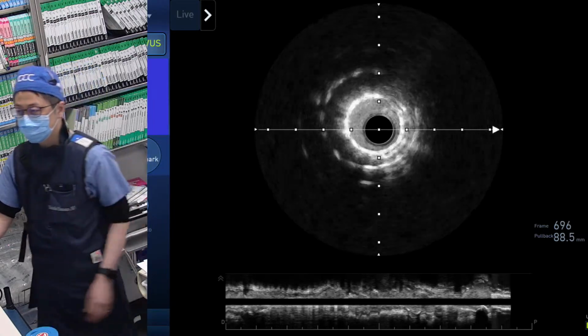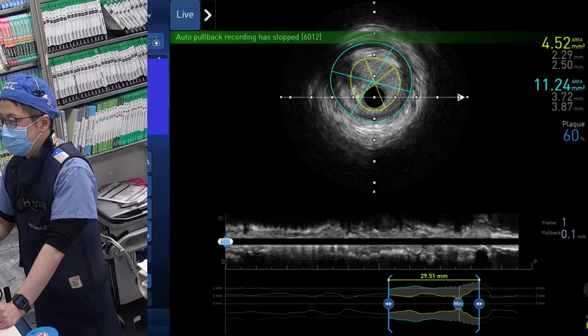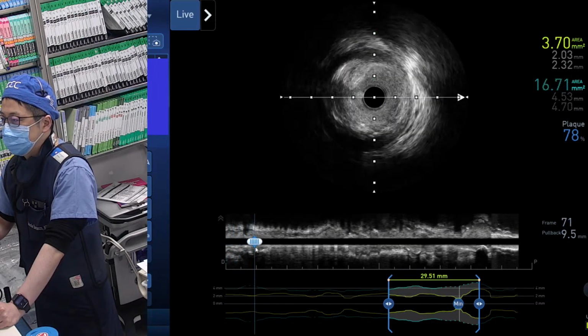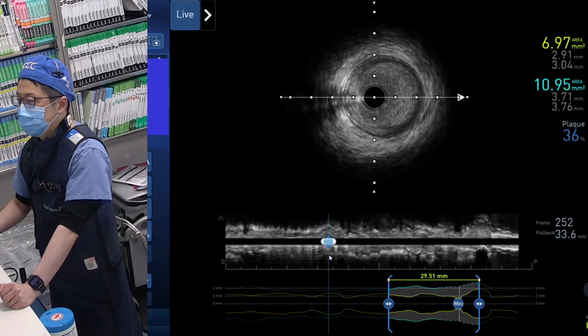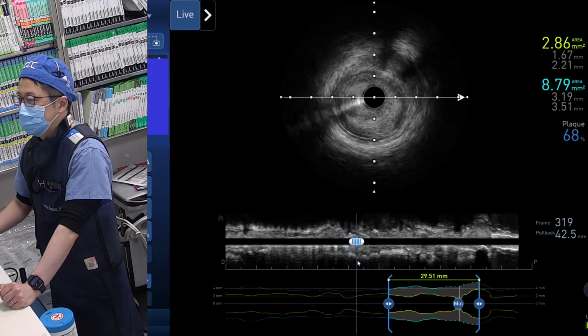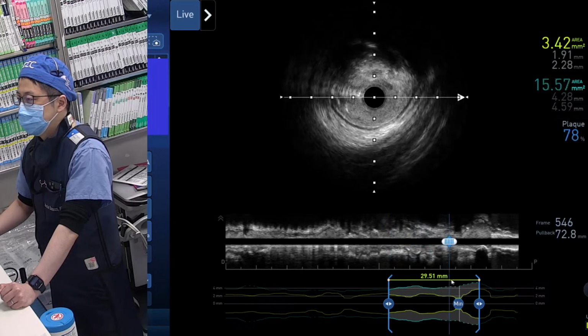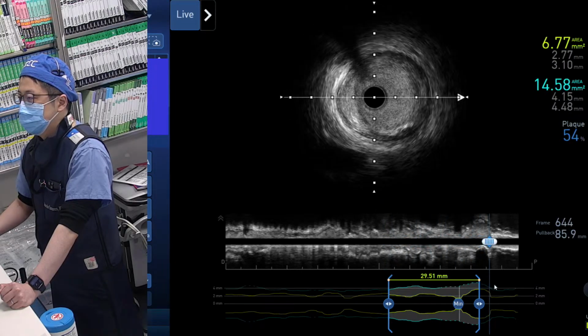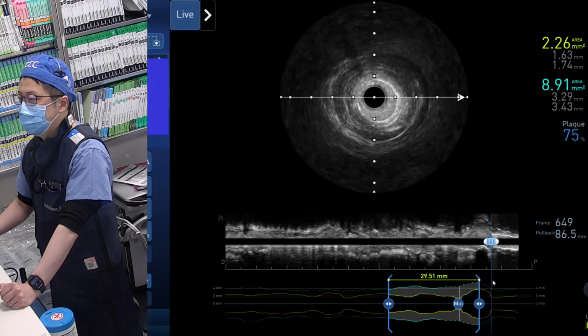Good, into the guide. Nice. So the distal, do you want to dilate first with the 3.0, or I think I would put 3.0 by 48 and leave it. Or we just go with the stent now and then post dilate, right? The length is quite long. It will be at least 60 millimeter.